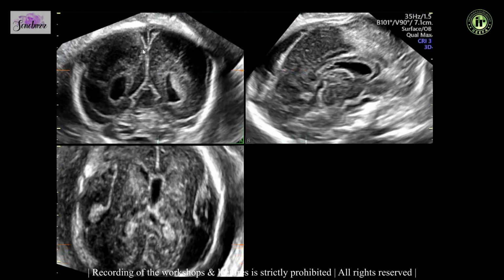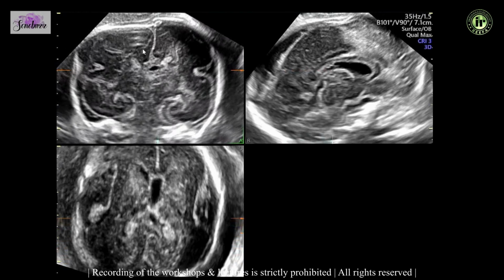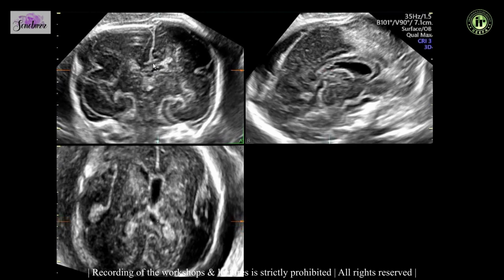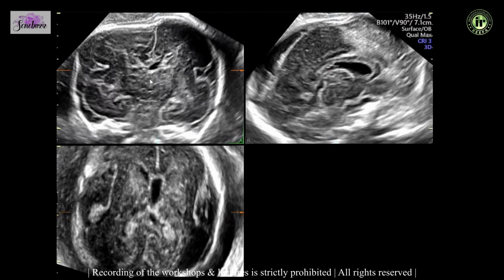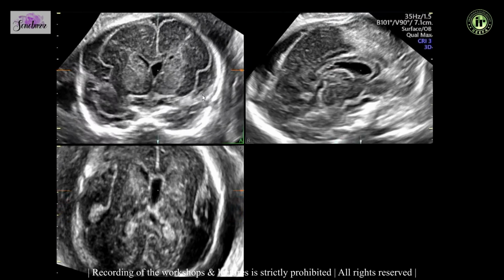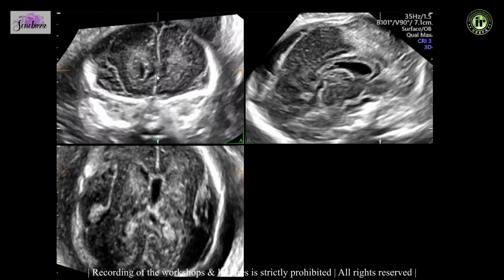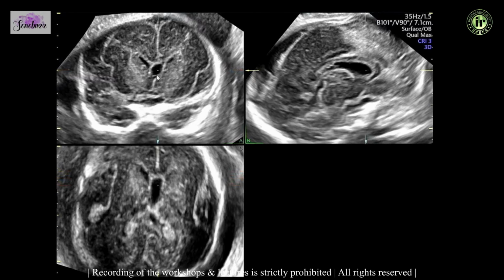and you come in front, scroll forwards, the choroid plexus body of the lateral ventricles. That's the corpus callosum and the cingulate sulcus here. This is the sylvian fissure. You can see the anterior complex, frontal horns, corpus callosum. And similarly, we can move to all the planes.